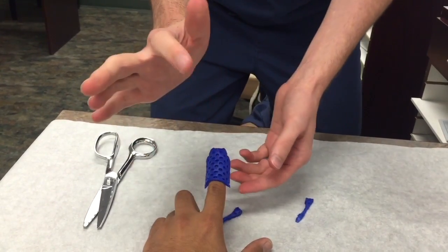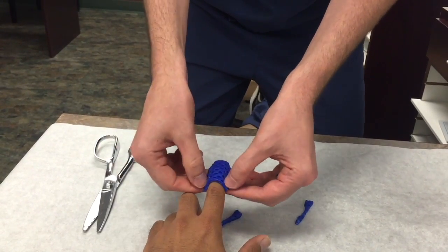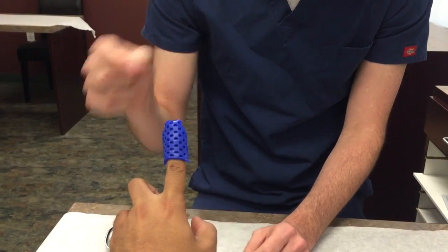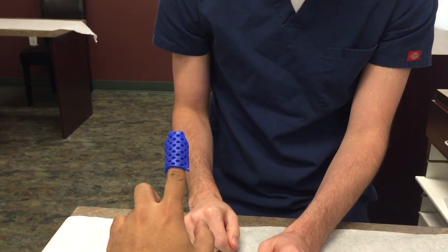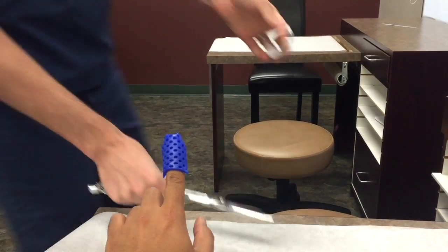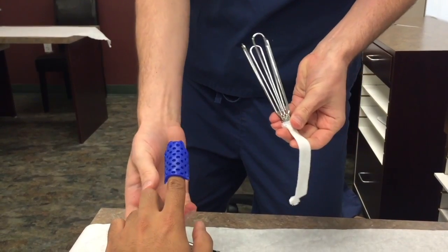Then you can smooth it out, wait for it to dry, and make sure they can flex their PIP. I usually have them pull it up so gravity helps push it down a little bit. Sometimes I'll wrap this with Coban if it's going to fall off, and sometimes I don't. In some circumstances I'll do something else — you have to do it really quick because this will stretch out.